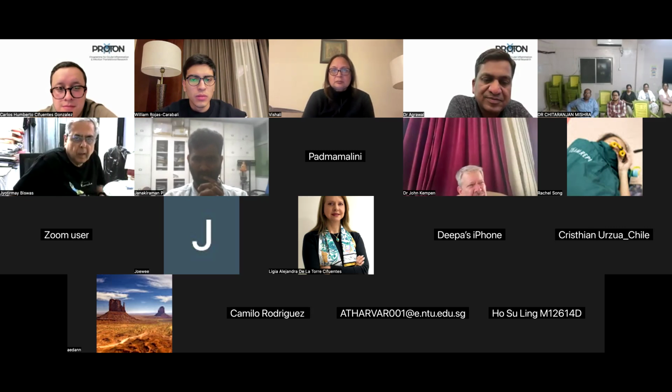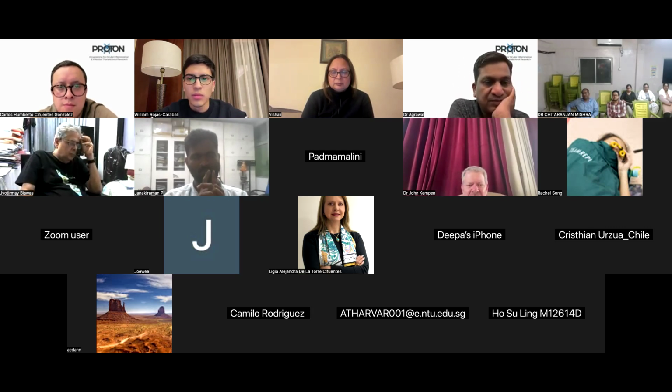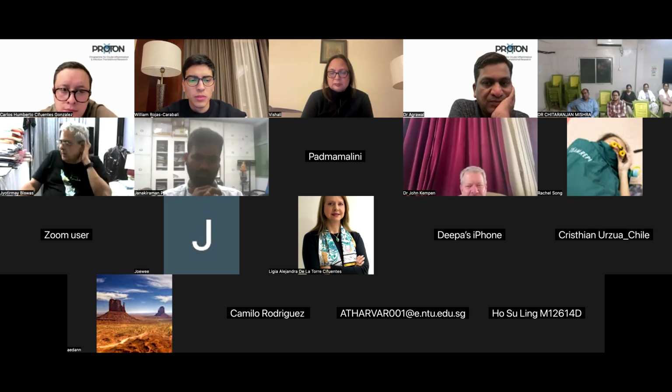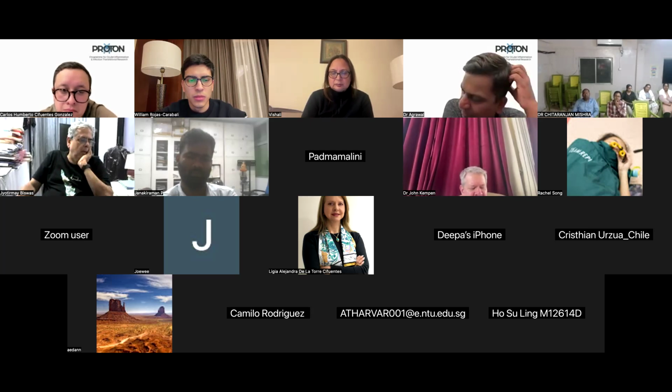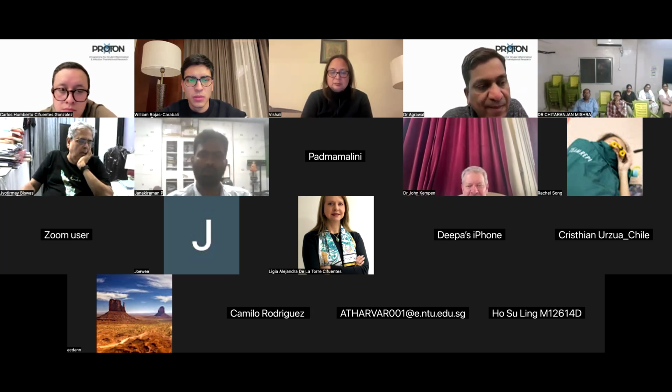We have a Clarus camera, not an Optos camera, so it's sort of intermediate. I think it's like 140 or 150 degrees. And it's rather nice, I think, because of the true color aspect of it, but it definitely doesn't reach as far as the Optos, maybe a little bit past the equator. We find that it works a lot better and seems much easier than the Heidelberg with the big one, and so we mostly have been using that. I think we would use an Optos if we had it.